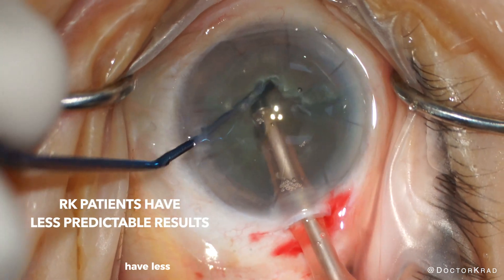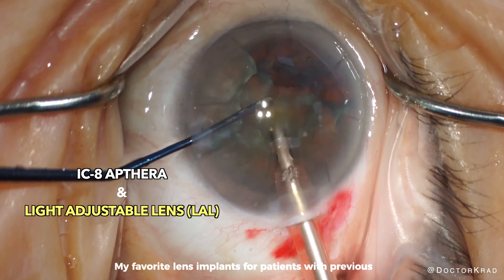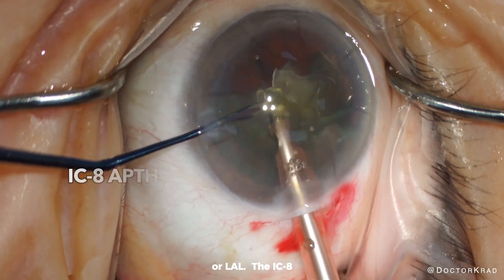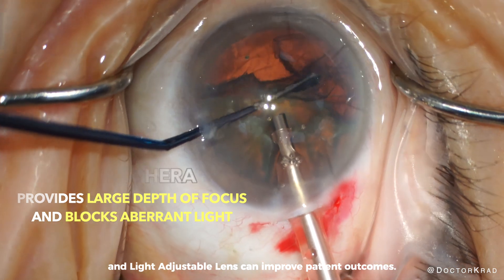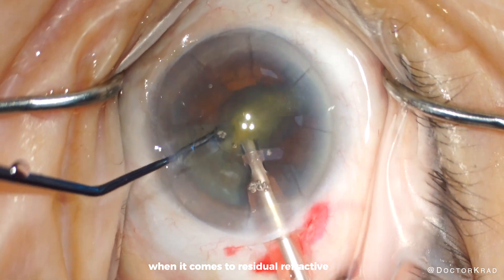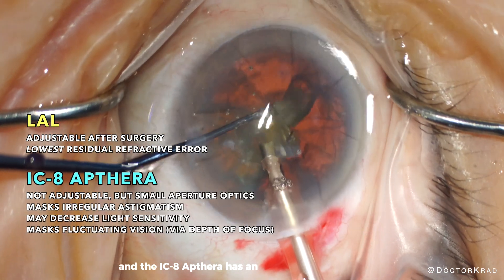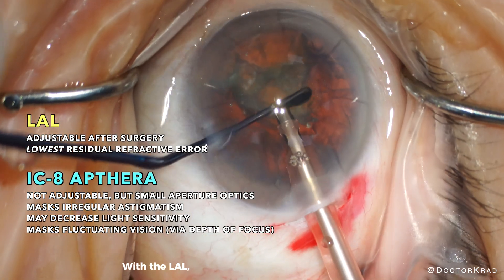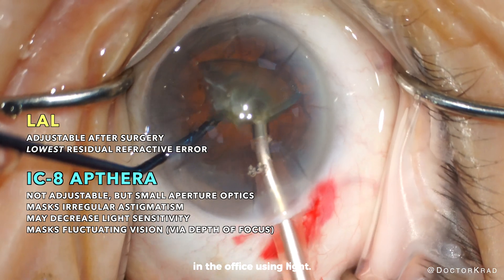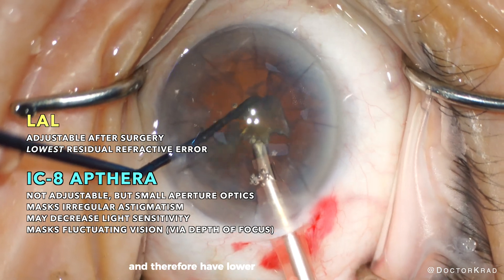RK patients notoriously have less predictable results after cataract surgery. My favorite lens implants for patients with previous RK are the IC8 Apthera and the light adjustable lens, or LAL. The IC8 Apthera and light adjustable lens can improve patient outcomes. The advantage of using these lenses is that they are both forgiving when it comes to residual refractive error. The LAL is adjustable after surgery, and the IC8 Apthera has an extended depth of focus. With the LAL, after the eye has healed from surgery, the strength of the lens implanted will be adjusted in the office using light, so patients will more likely end up at or near the intended target refraction.